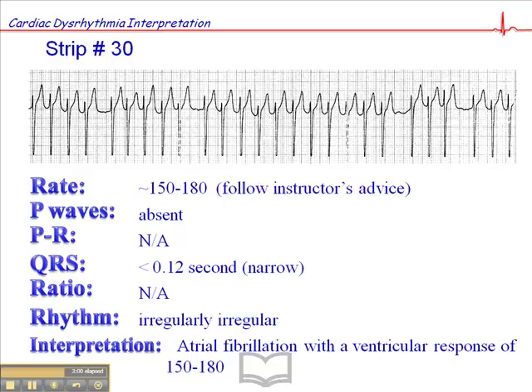So what might look like a regular beep-beep-beep-beep on the paper, when you listen to it, it's more like an irregular beep... beep.. beep... beep.. beep. beep... beep.. beep, with varying intervals between beats. So you'll definitely hear that auditory clue that it's irregularly irregular.